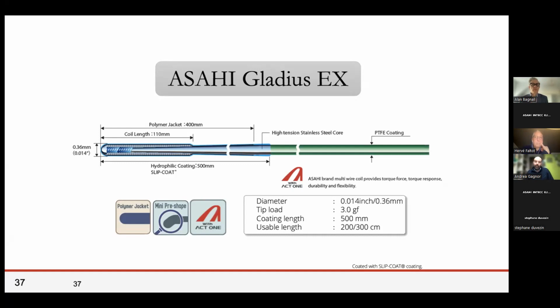So once again, we have a new wire, which is, I have to admit, a game changer more than expected. I hadn't had a lot of expectation on this wire when it came on the market, but now I use it in a very high percentage of my procedures. When I don't know the anatomy, when I have calcium, and when I want to try to clarify without being too aggressive, I try to use this kind of wire before starting knuckling and migrating in other spaces. I can try to stay in the true lumen for a little bit more.